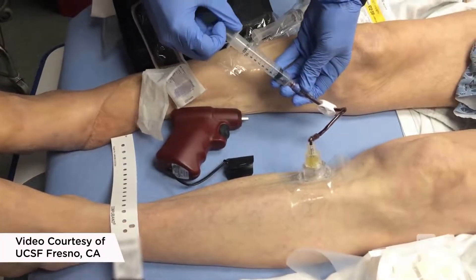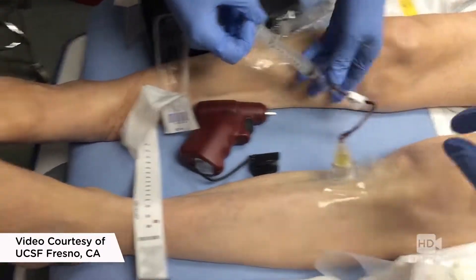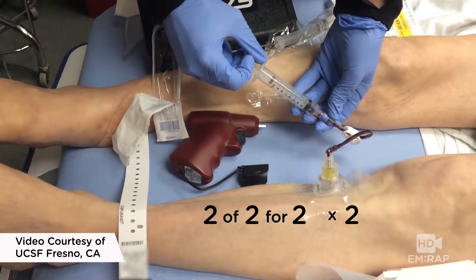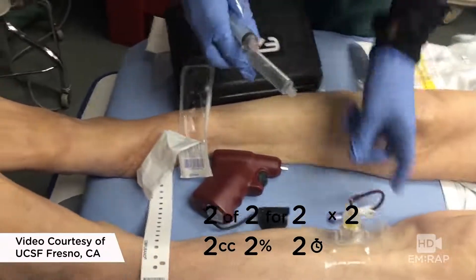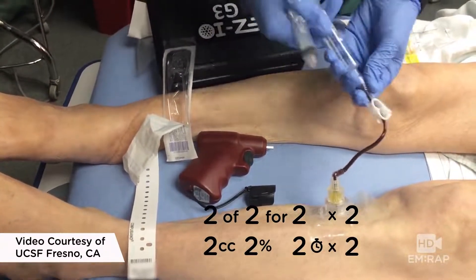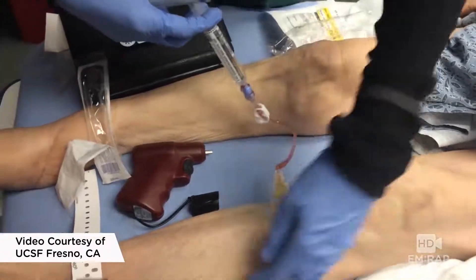If you're going to do this in an awake patient, I recommend using some anesthesia. You can use my mnemonic: two of two for two times two. That's two cc's of two percent lidocaine over two minutes, then do a flush and wait, and then repeat it — so times two. Two of two for two times two.